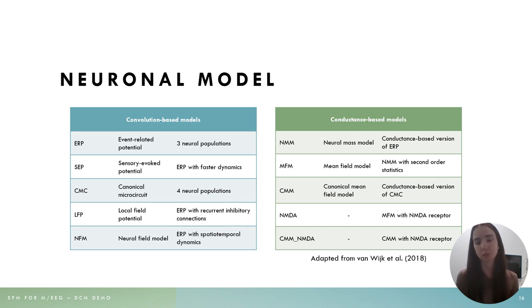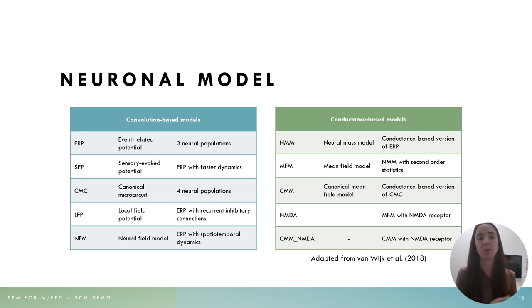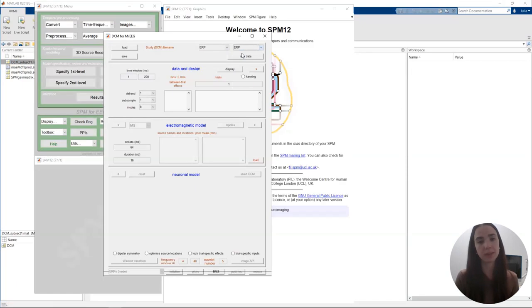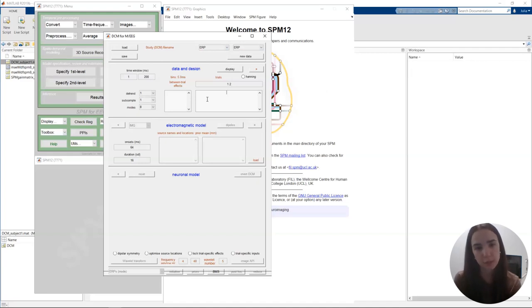For example, in my PhD research I'm interested in NMDA receptor hypofunction in emerging psychosis, so I often use the CMM model with NMDA receptors. But if you're not interested in NMDA receptors, don't use this model — use a simpler version. We're going to go back to MATLAB and select our neuronal model — in this case ERP — and then move on to the first section called Data and Design.